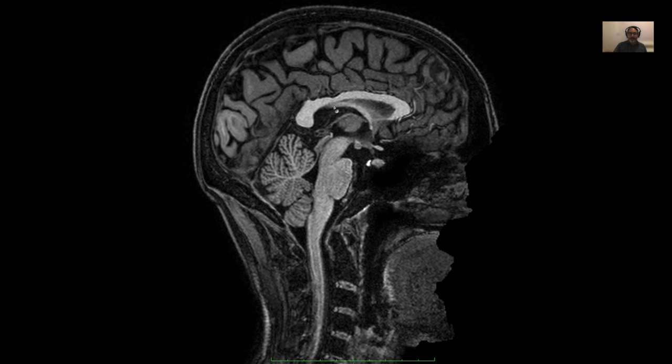Now, if that's the midline, what else? You should be able to see the nice fourth ventricle in the midline. The third ventricle is right here. And the lateral ventricles you can't see in the midline because they're on both sides. Into the screen and outside of the screen, that would be your lateral ventricle. That's your third ventricle, and this is your fourth ventricle.